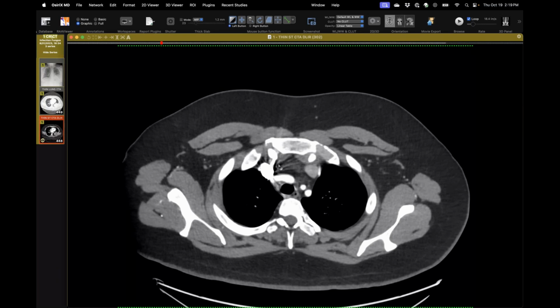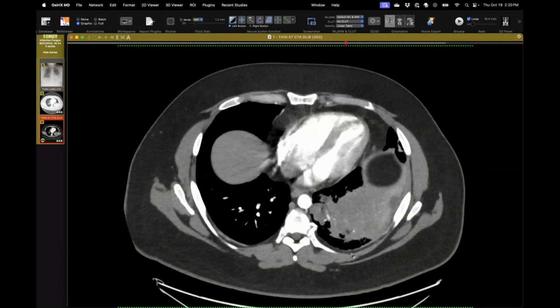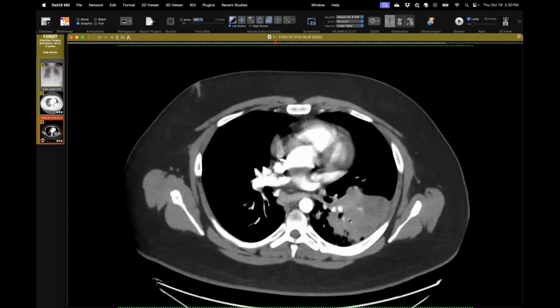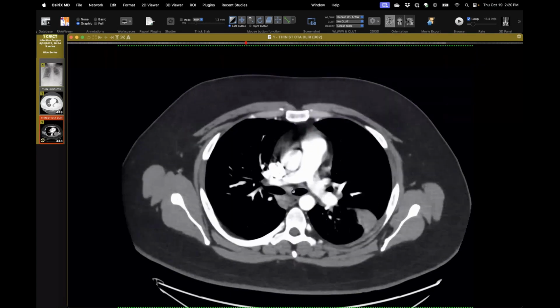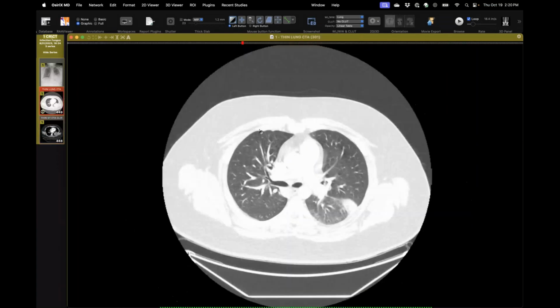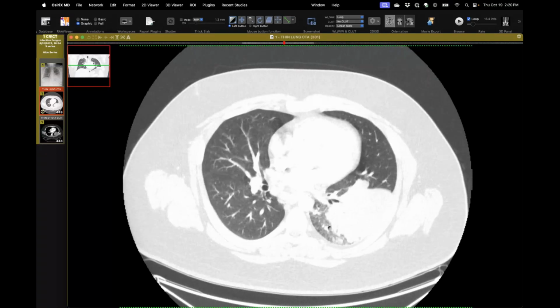And the reason I pointed out the effusion is that that can be helpful. Most bacterial pneumonias, in my experience, have some pleural reaction when they're this big and up against the pleura, and you just tend not to see that with blasto, where it's a small effusion. And the degree of lymph node enlargement is usually disproportionately small, unlike histo, where we get big chunky nodes. And again, even bacterial infections tend to cause more inflammation. If you look on the lung windows, you can see it's pretty well circumscribed, but has this blobby appearance and some satellite nodules as well.